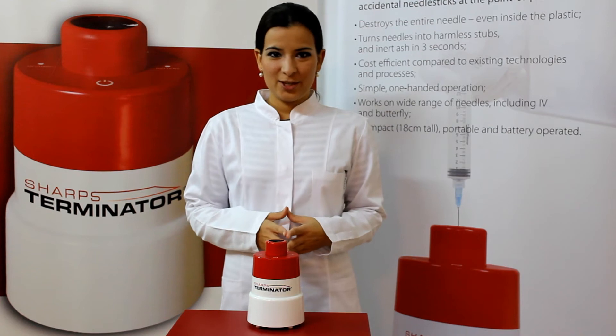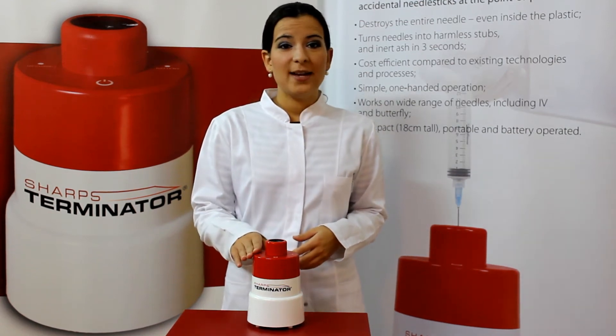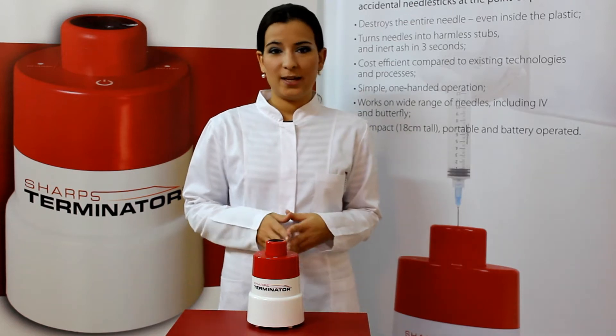Welcome to the video presentation of the Sharps Terminator. This device was created to provide a safer workplace for healthcare workers.